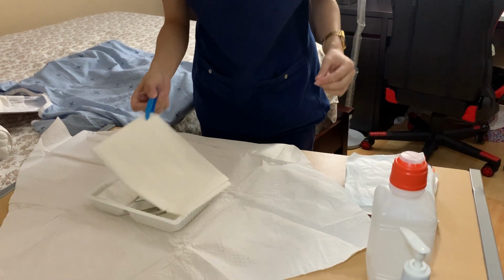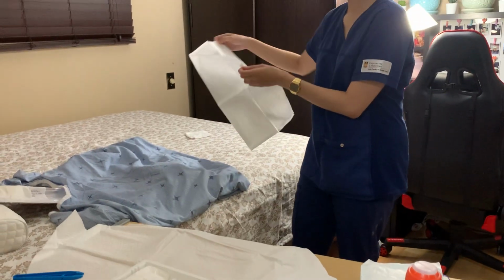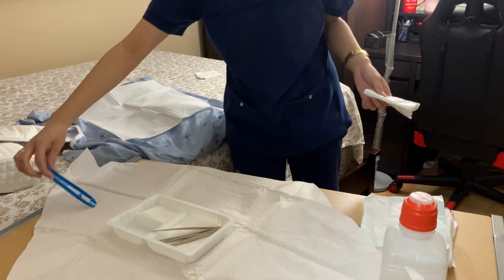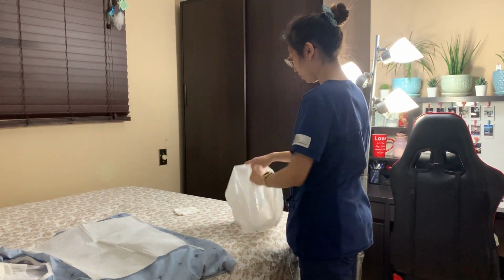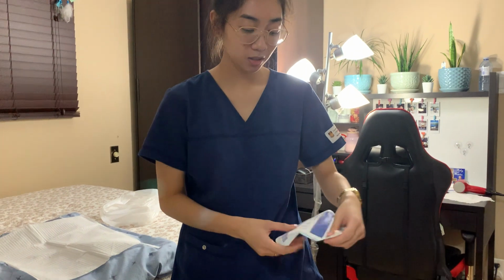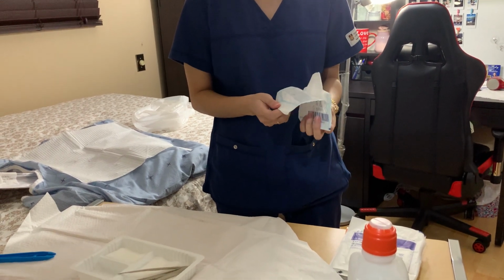I'm going to grab the drape. Okay, now I'm going to grab my garbage. Okay, and I have my drain sponges here, my 4x4. It has already been opened since I'm reusing my supplies, but in real life it would be closed.